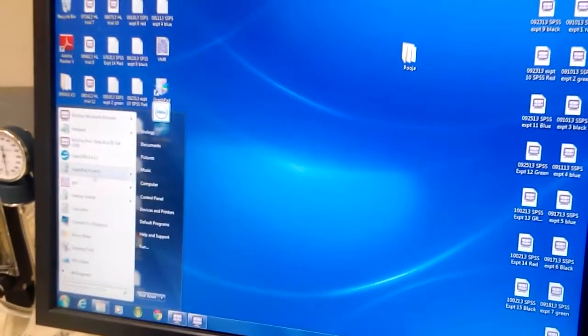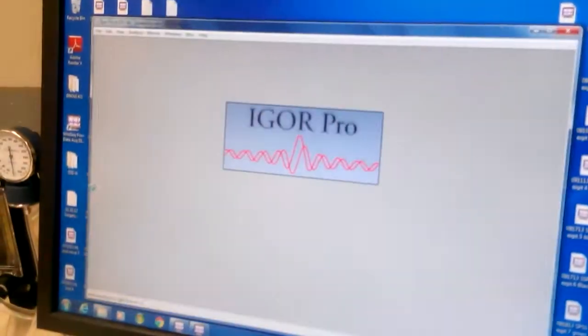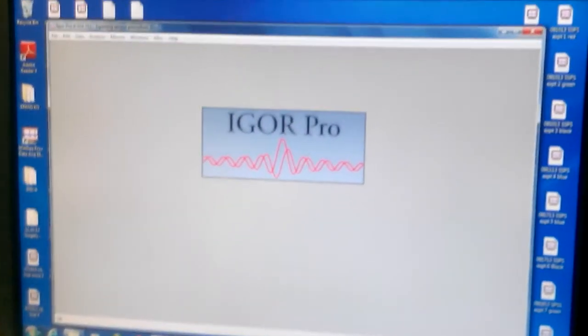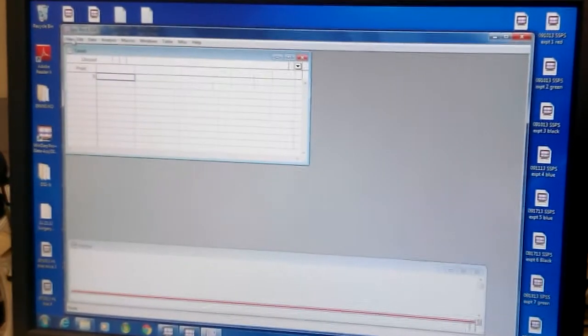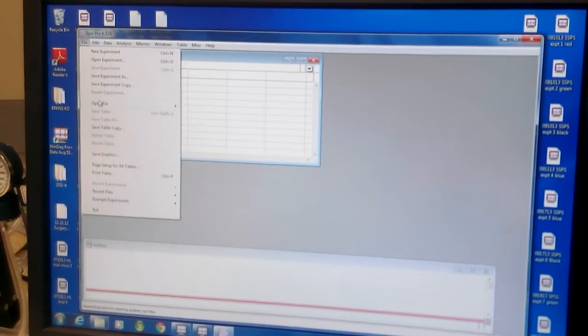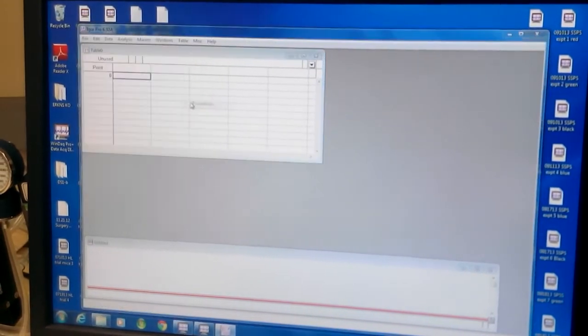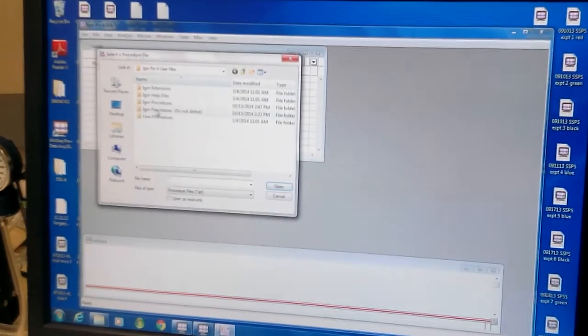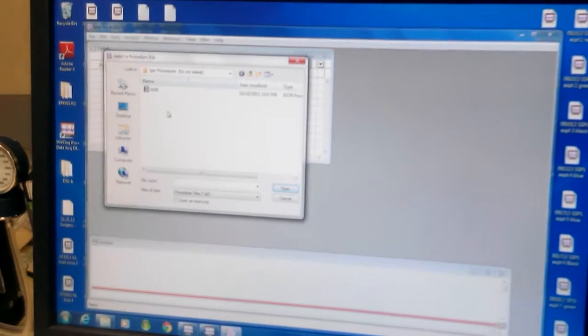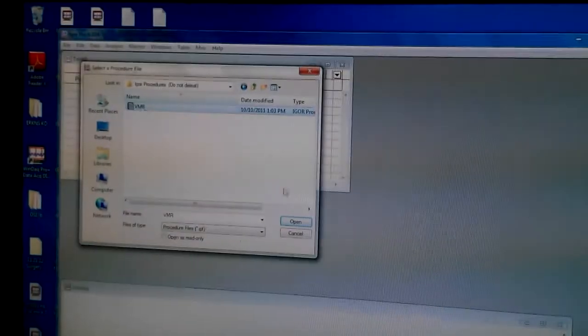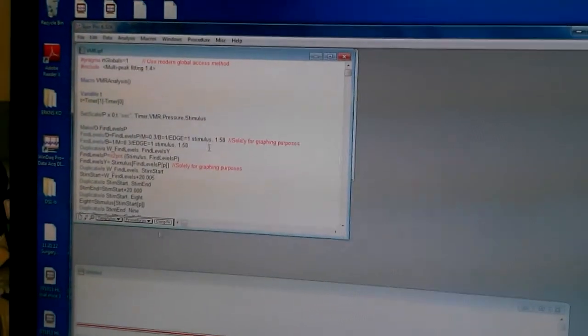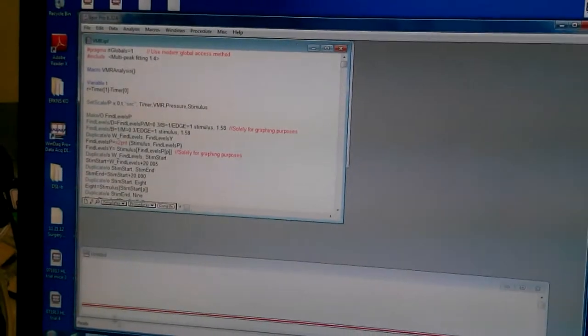I got the program. It's actually the start button. You go to file, open file, procedures. You go to Igor procedures, do not delete. Click this VMR, open. This comes here.